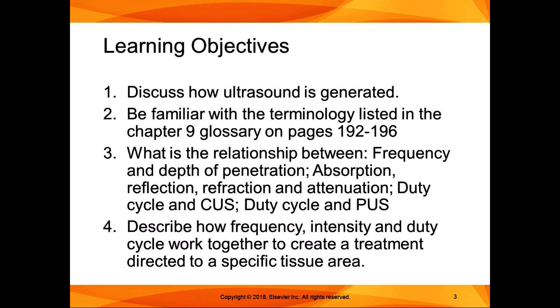So I want you to know what the relationship between frequency and depth of penetration is. I want you to know the relationship between absorption, reflection, refraction, and attenuation. All that terminology right there in that objective. And the relationship between duty cycle and CUS, which is an abbreviation for continuous ultrasound, and PUS, which is an abbreviation for pulsed ultrasound. I want you to be able to describe how frequency, intensity, and duty cycle work together to create a treatment directed to a specific tissue area.